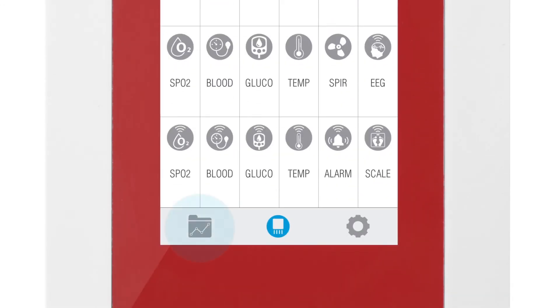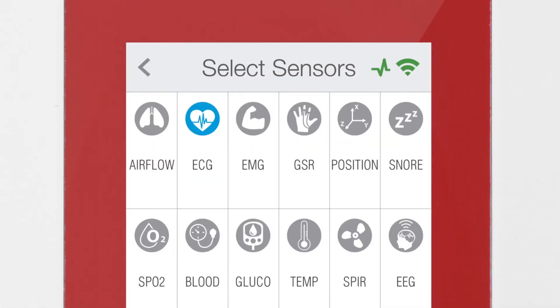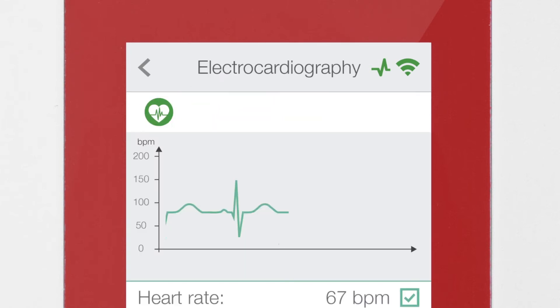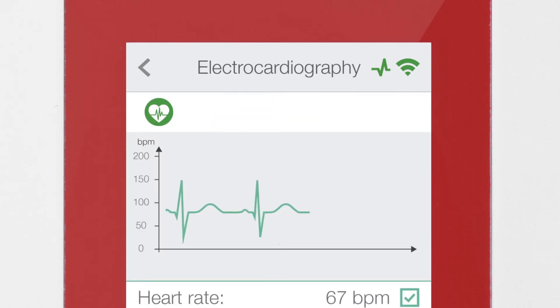Then click on the Data button to access the Data screen and start visualizing the data. Click on the sensor you want to start watching real-time data.